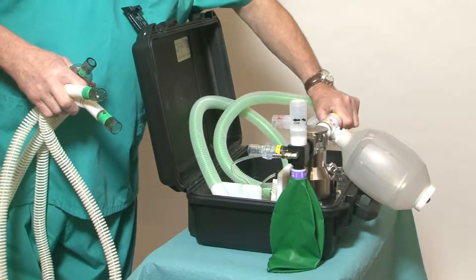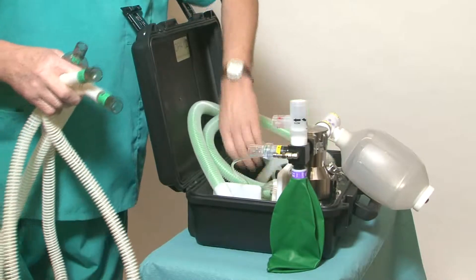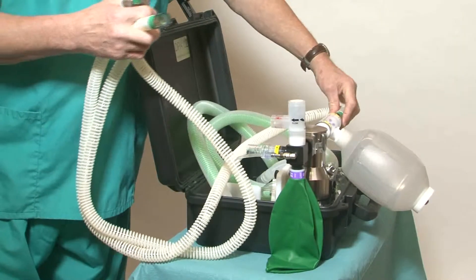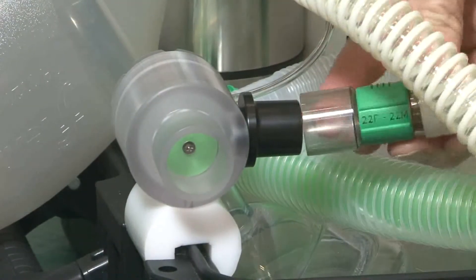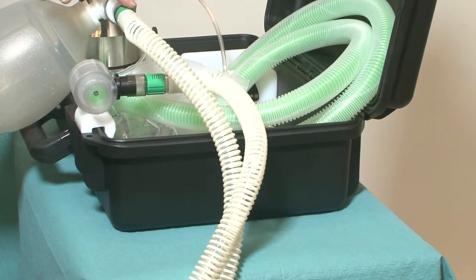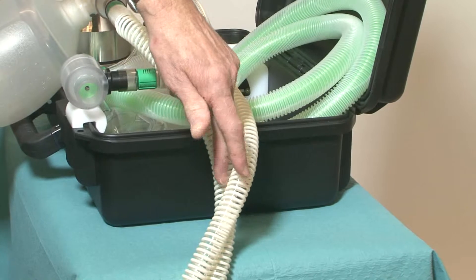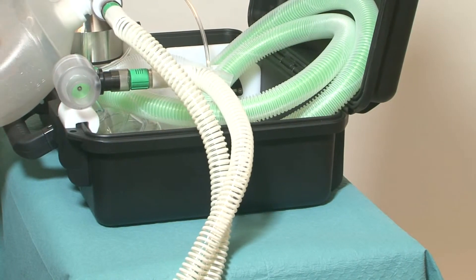This becomes clearer if we change the circuit for a standard two-limb Y-piece. One side of the tube connects to the clear valve and the other side connects to the expiratory valve. Now we can see the gas flow down one side of the tube and back down the other side.